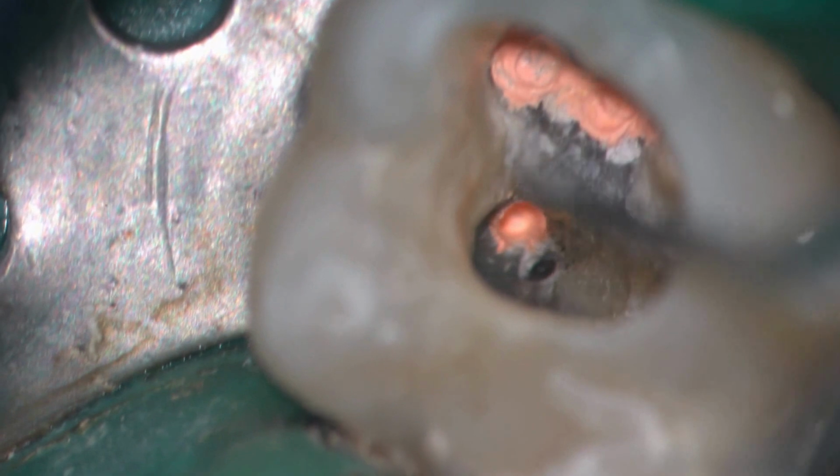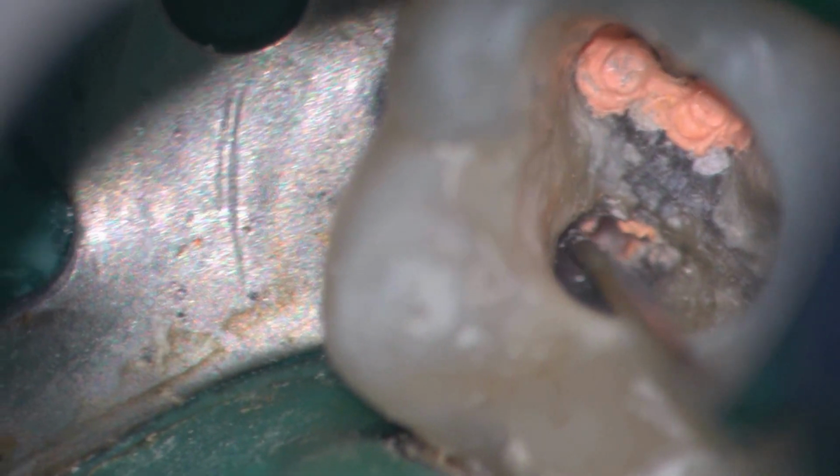So you can see I placed the cone with the sealer, careful not to spread sealer around the periphery, and now I go through the sequential downpacking with the multiple waves of condensation. You can see as I progress apically, I'm taking small bites of the gutta percha, removing them without trying to do too much at once so that I don't spread the material out to the periphery and into the cleaned resorption prep.